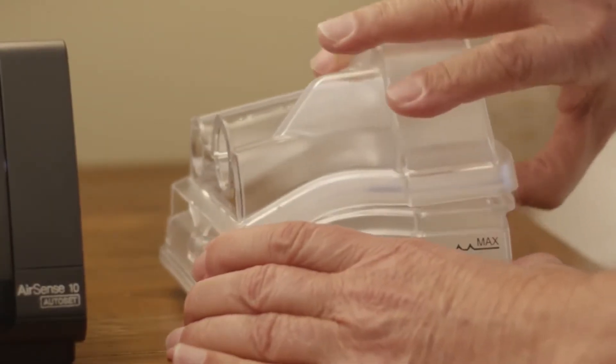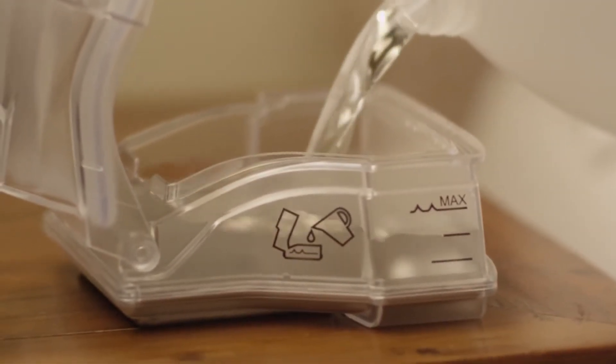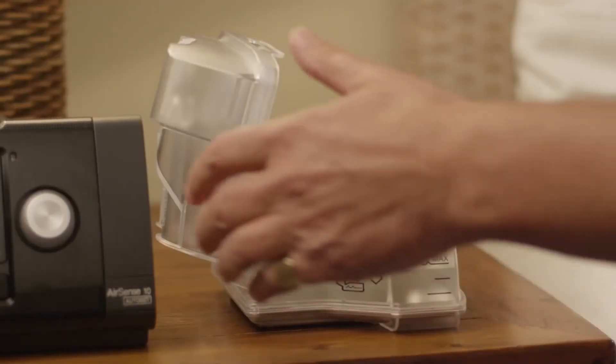Simply take the water tub, open it, and fill it to the maximum water level mark with distilled water. Then close the tub.